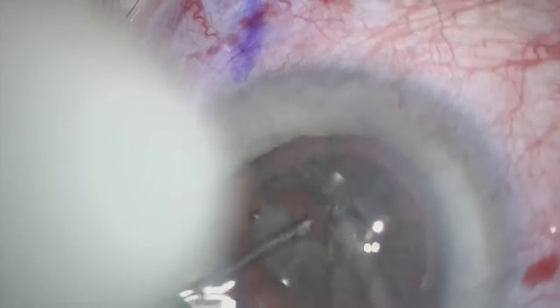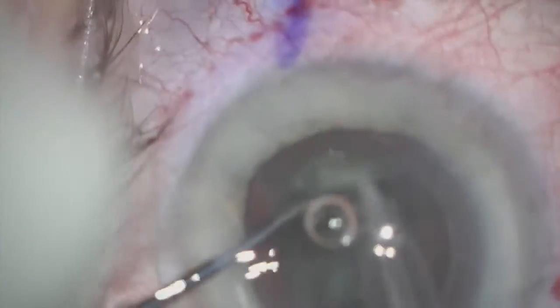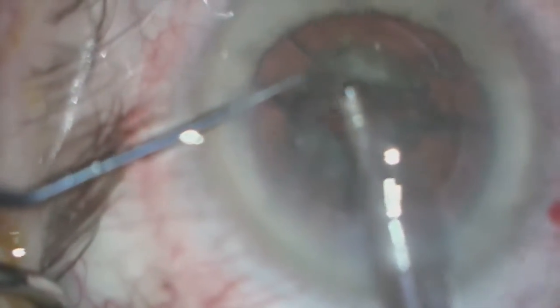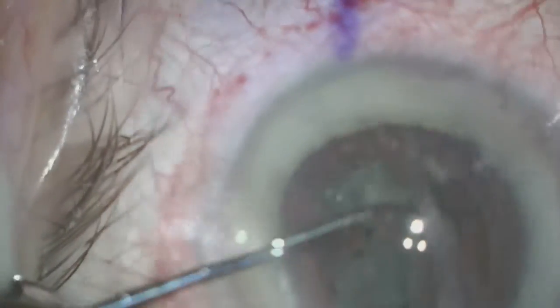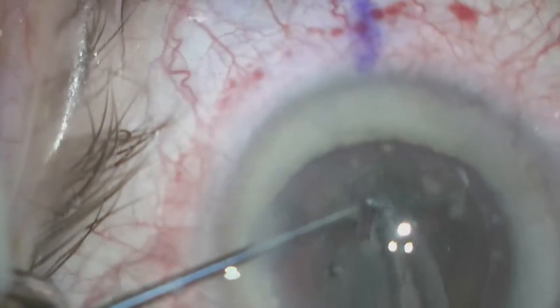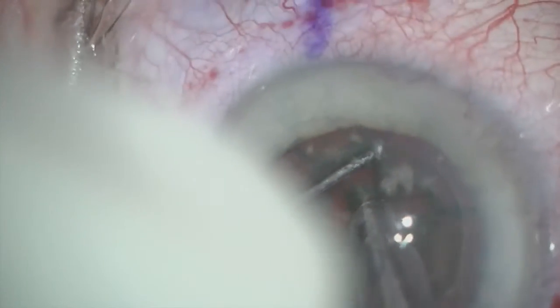This nucleus was very soft since it had already been fragmented by the femtosecond laser. The majority of what was used during this case is irrigation and aspiration. Very little phacoemulsification power was used, and the lens came out of the bag successfully.